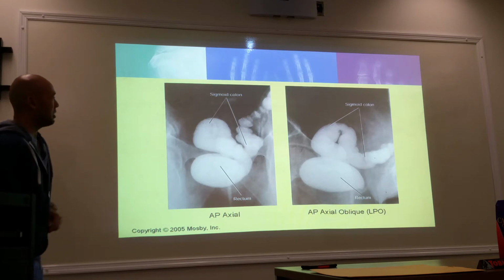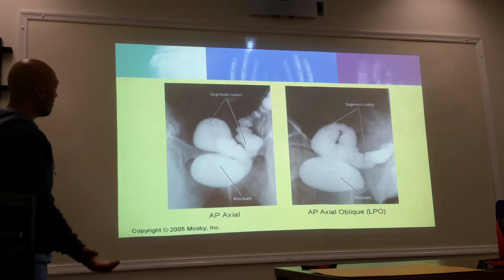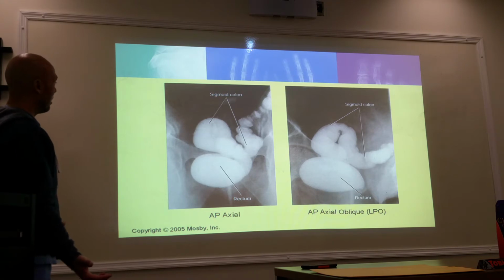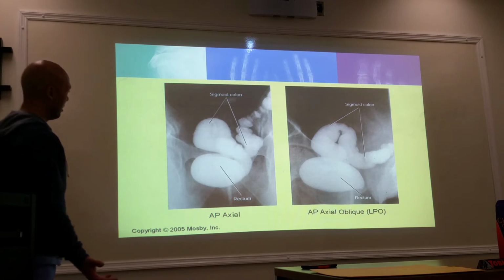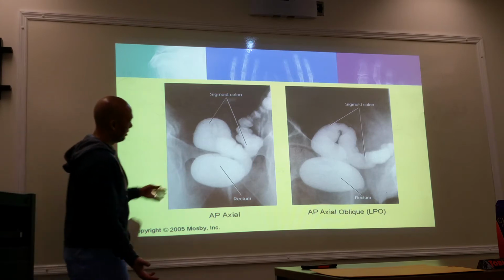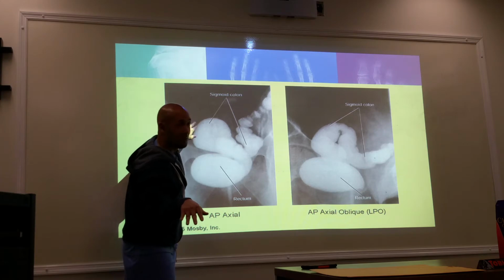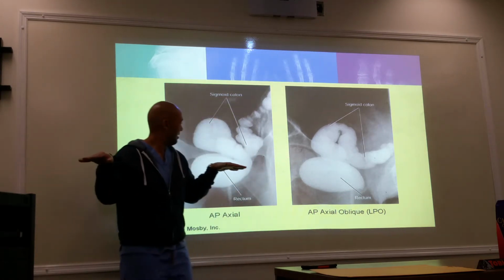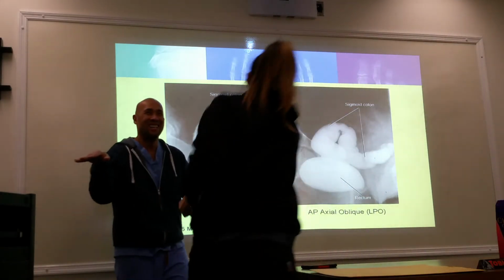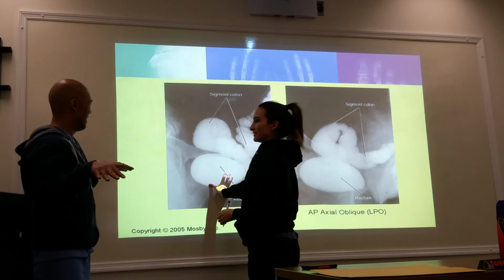This is what we call the butterfly view. You don't see the butterfly? Look at the bones. It's the pelvic bones. These right here are the wings. The gray sides are the wings, and the contrast area is the body of the butterfly. Looking at it straight on, the pelvic girdle is the wings, and this is the body.